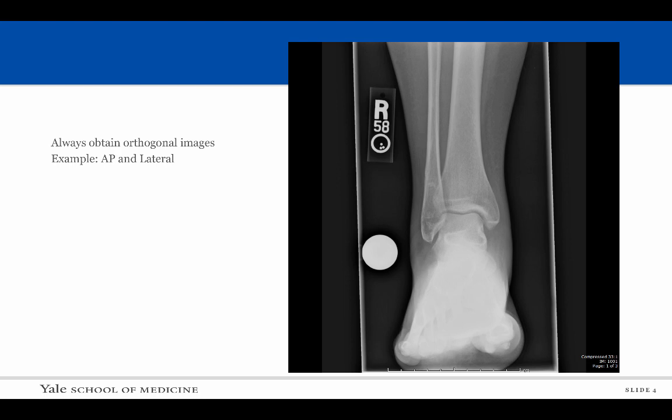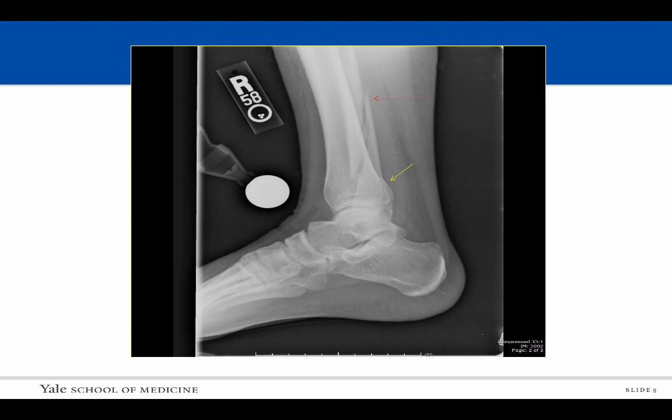Let's look at this patient who presents to us with ankle pain. There is no obvious deformity or fracture identified on the AP radiograph. However, careful examination of the lateral radiograph demonstrates the presence of an oblique fracture through the distal fibula, denoted by the red arrow.